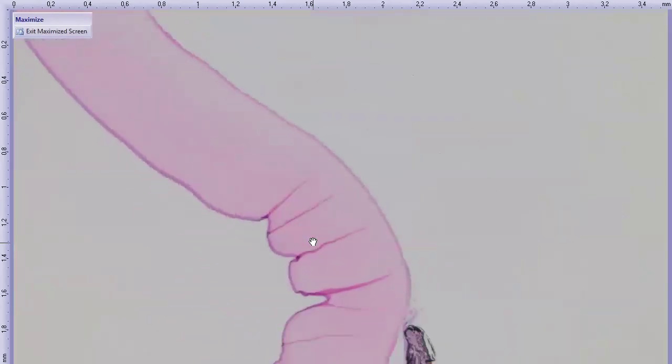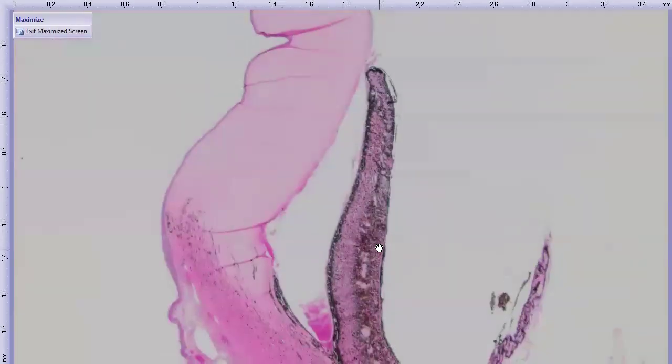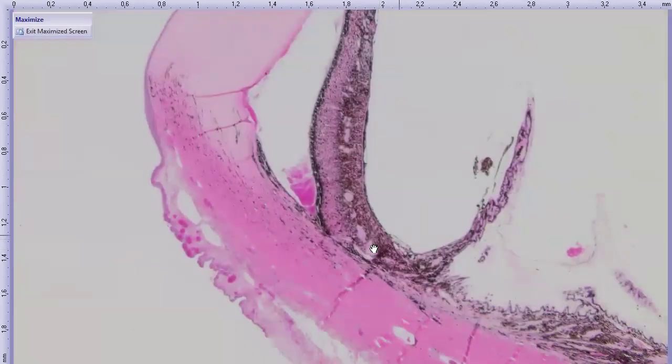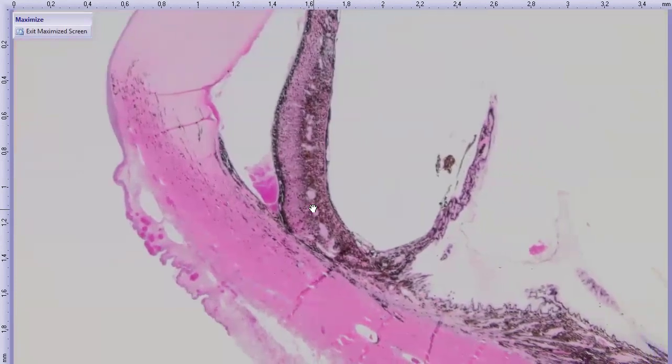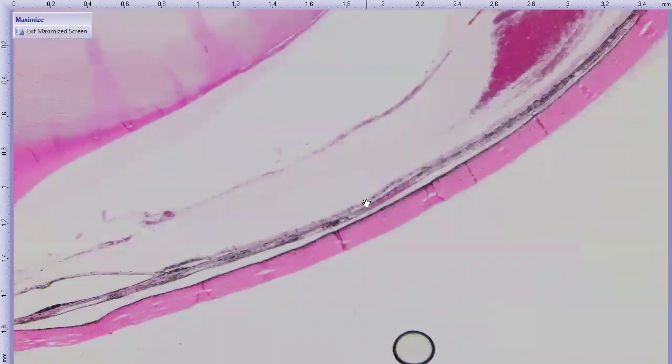All right, so here's our cornea. We can see it's a little bit thick and irregular, and we'll take a closer look at that in a minute. Here's a little bit of that settled hyphema. We've got some membranes crossing this angle, causing peripheral anterior synechia. Again, here are some of those membranes on the ciliary body and lens capsule, with a little bit of hemorrhage.